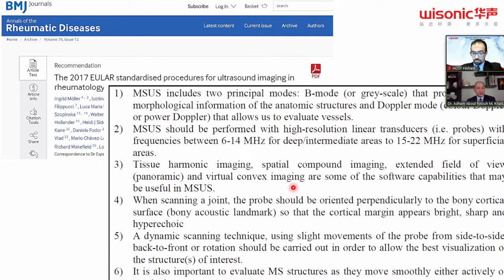So you have to get yourself acquainted with the machine. You have to know the different techniques, some primitive physics of the ultrasound machines, and some knobology or special settings. Those are very important. Even if you're a good sonographer and you have a good machine, you will need those to improve the image. And of course, they continued with enumerating the advantages of using ultrasound and how to set up the environment for it, including that ultrasound is the only dynamic modality to scan. Neither X-ray, CT, nor MRI is dynamic or frequently used as dynamic.